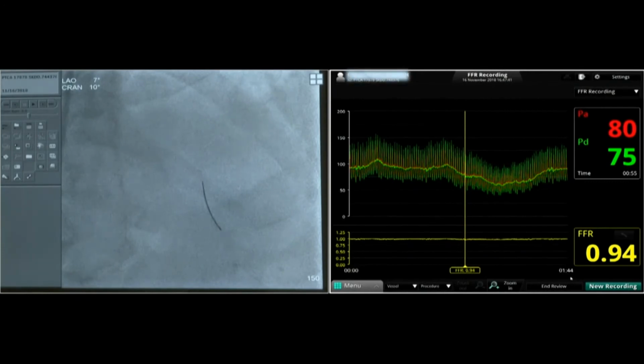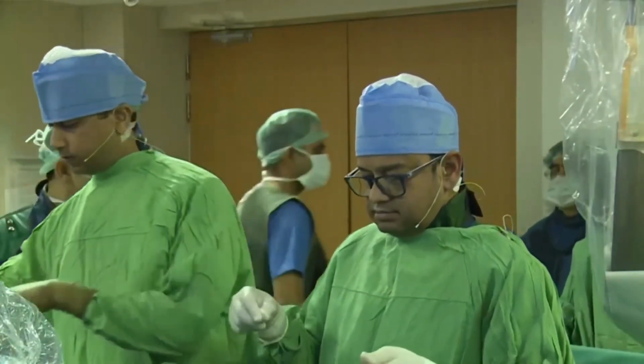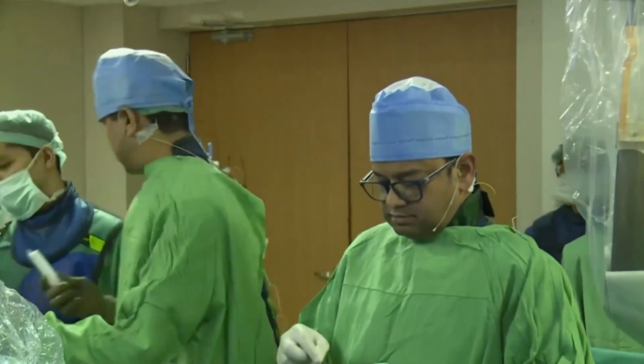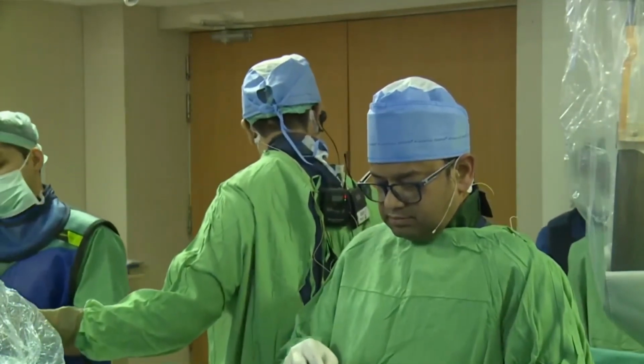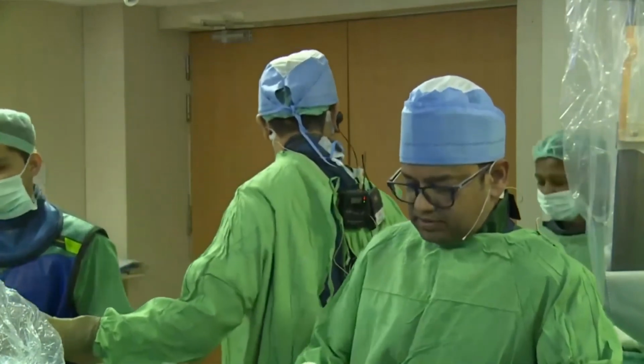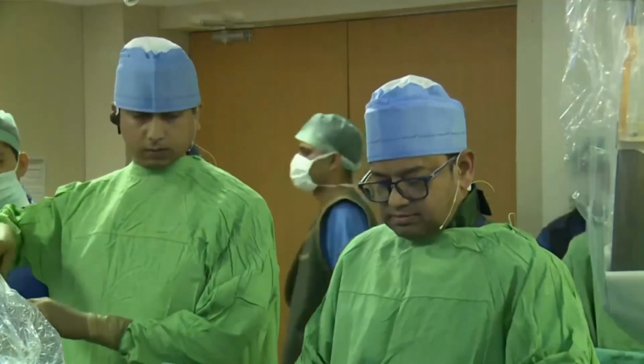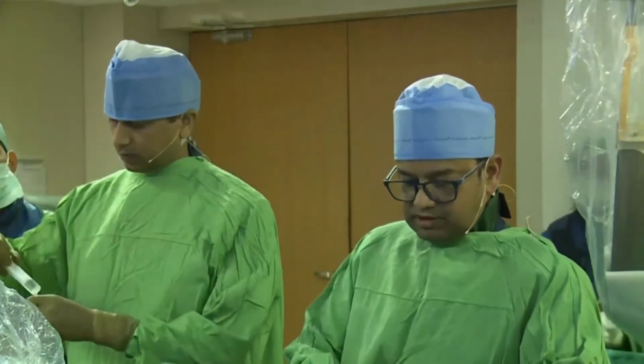This is what our hypothesis is going to be, to have it greater than 0.9 and see what that means with patients less than 0.9. So the proximal end will dilate with 3.5 and then take a final shot. Can you connect it? Yes, sir.